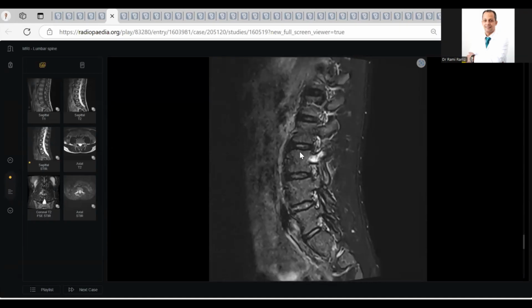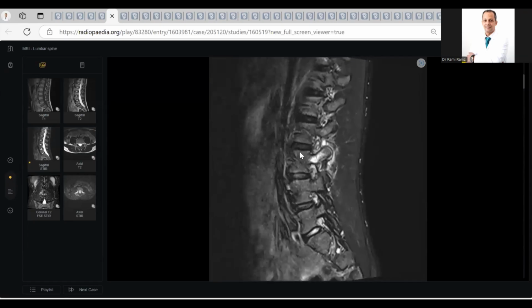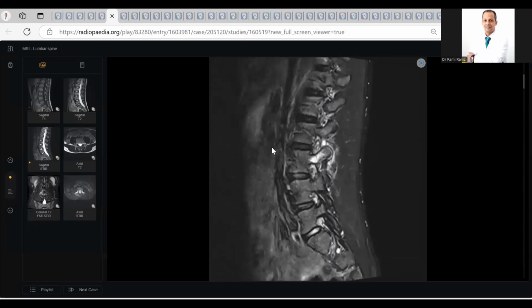I am provided with MR lumbar spine of a 14-year-old patient, and I could appreciate some hyperintense signal within the pedicle and lamina of the L3 vertebra. I want to confirm if it's on the right or the left. The rest of the vertebral body heights and intervertebral disc signal is normal. I could just appreciate an edema signal. Can you please scroll it?